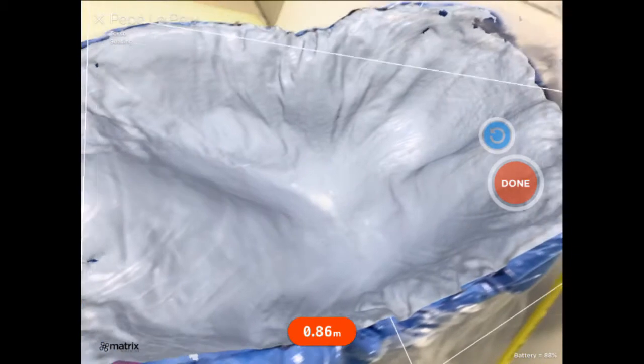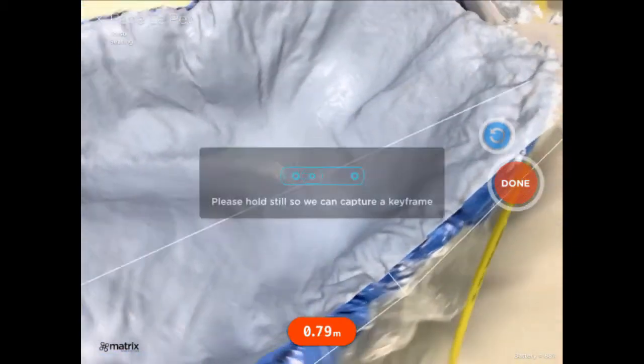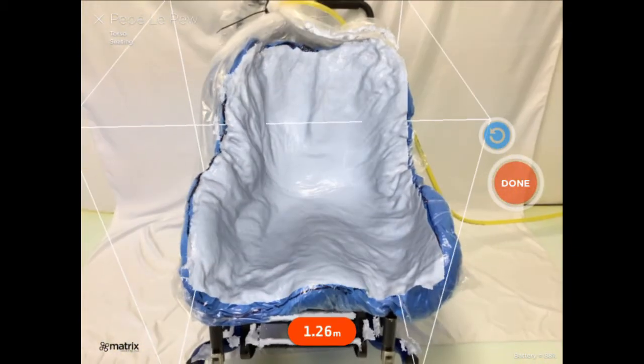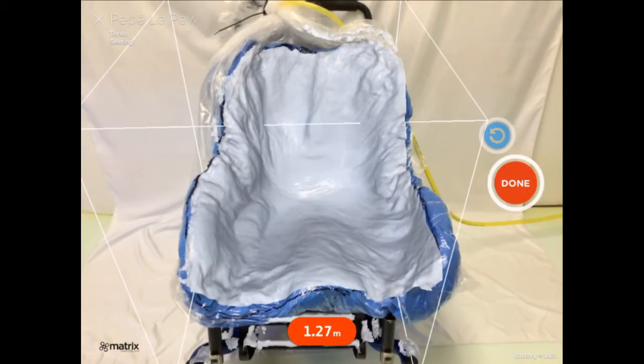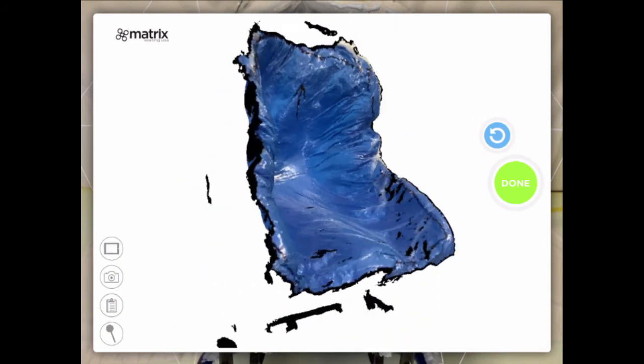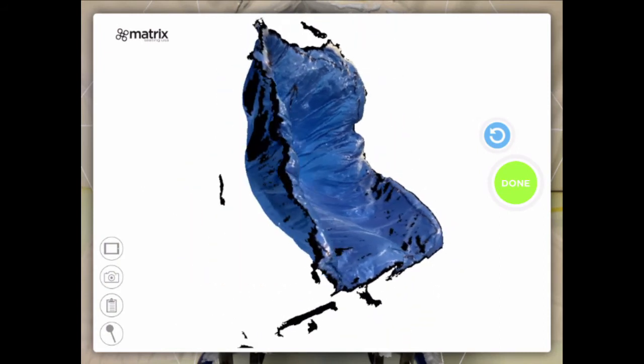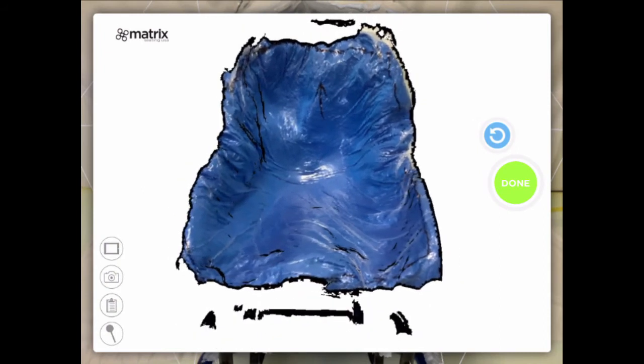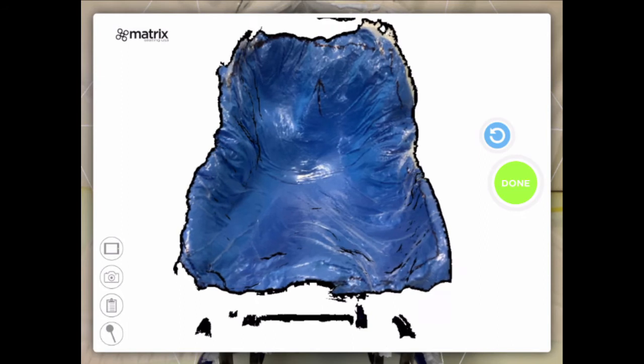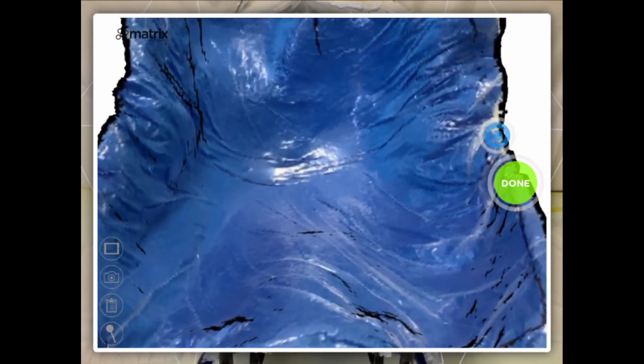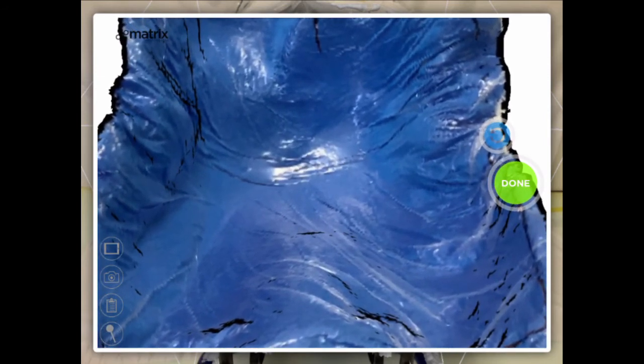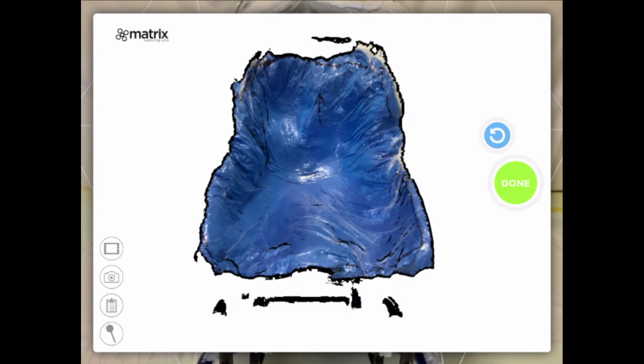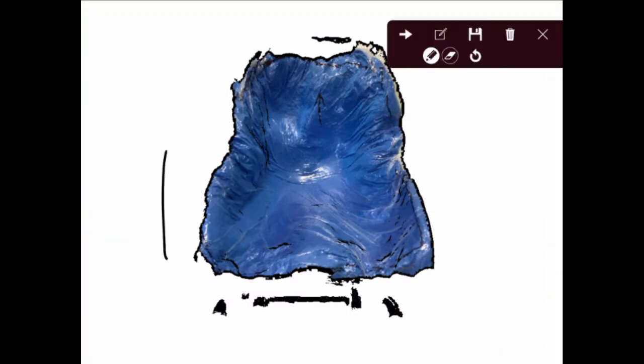When you're satisfied with the quality of your scan, click the red Done button. A 3D scan of your object will appear. On this screen, you can rotate, zoom, and inspect your scan. Confirm that you have captured the entirety of the object's surface and that there are no large holes. Also confirm that the black lines drawn on the bag are visible.